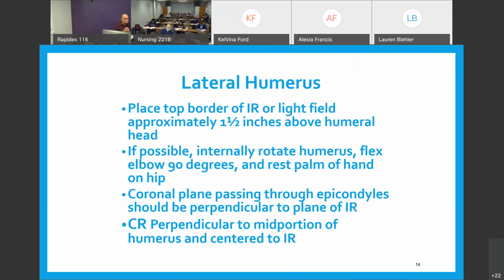Everybody see that? I can tell you, and Ms. McKnight, you can speak on this. I've always done mine on the top image. I've never done mine from the back. Regardless of how the patient came in, I was always able to get them done this way. So this is going to be what? Lateral medial, right? Going this way. So I saw that on there. I said, well, I've never really done one of that, but it makes sense.